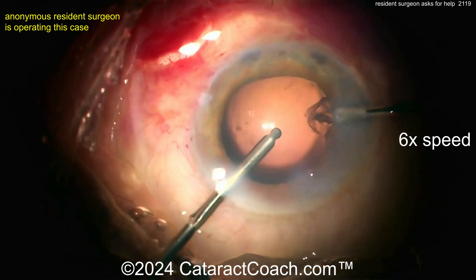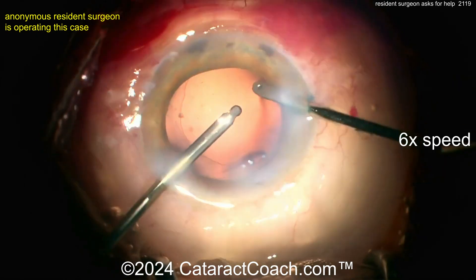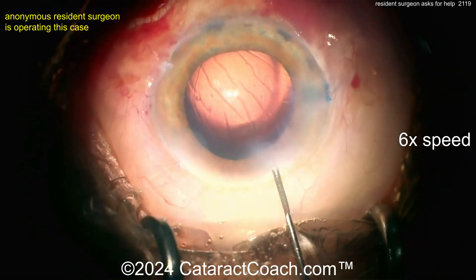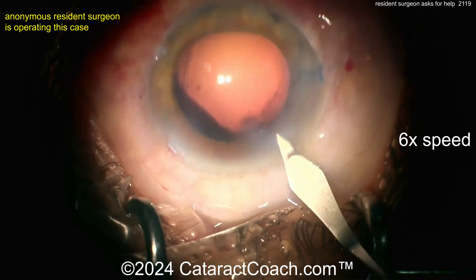Now taking out the lens cortex is pretty good. Let's see what we've got for the lens insertion. This video is at 6x normal speed so it is really fast. There are a lot of wrinkles in the cornea — you see those wrinkles, those Descemet's folds? You know what you're going to see tomorrow? Descemet's folds on the slit lamp.